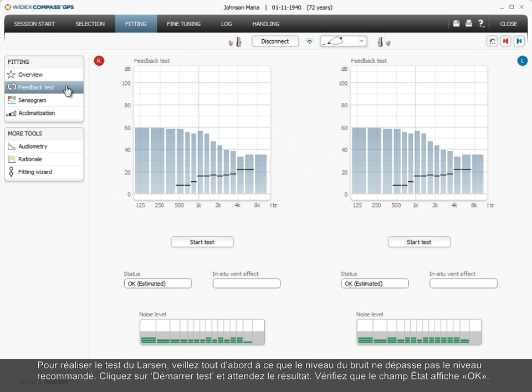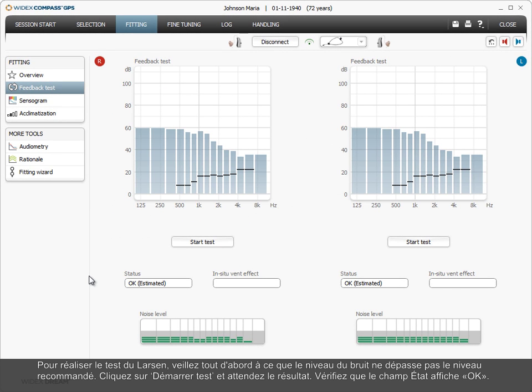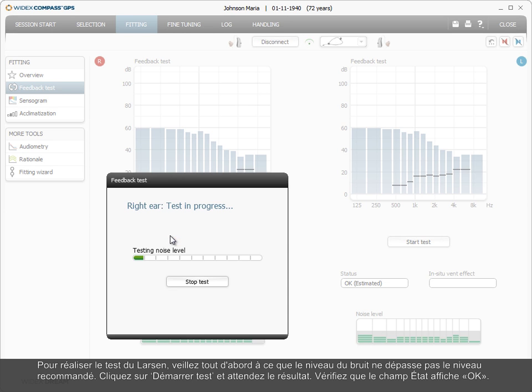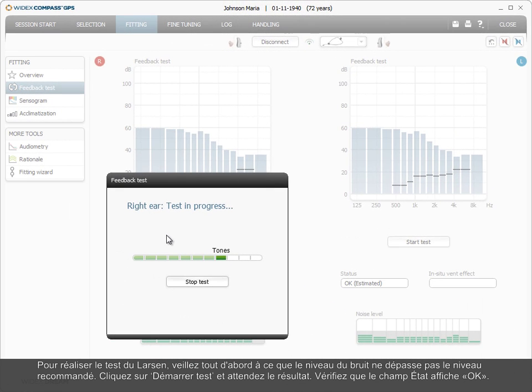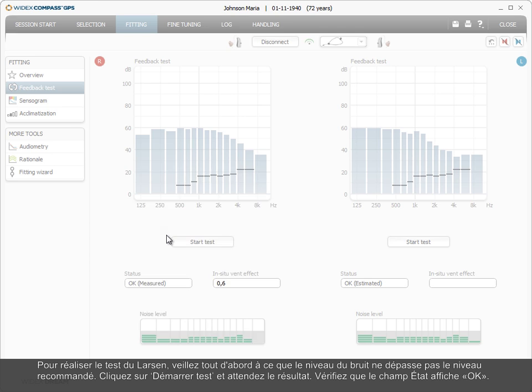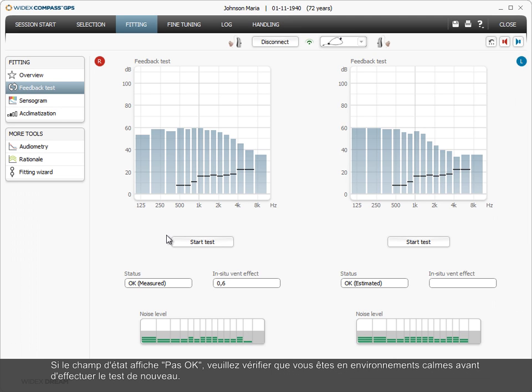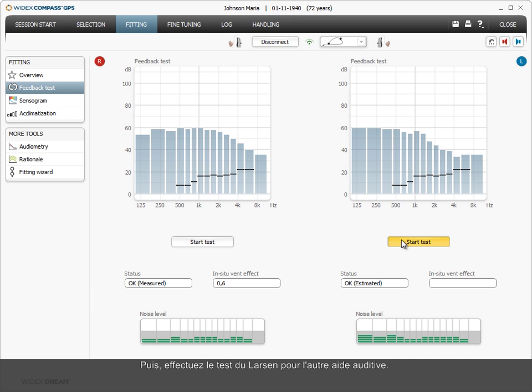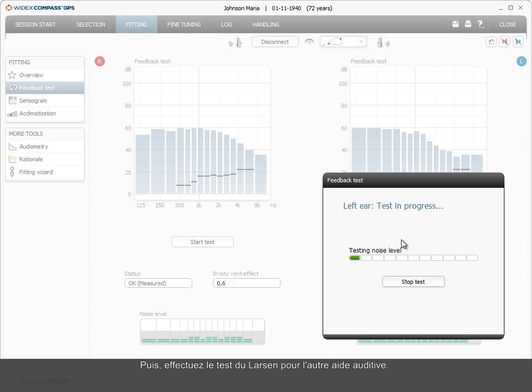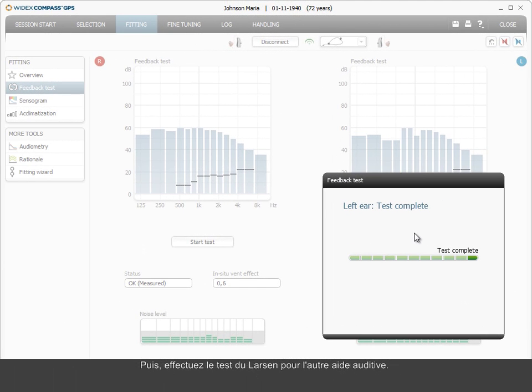To perform the feedback test, first ensure that the noise level does not exceed the recommended level. Click Start Test and wait for the result. Check that the status field shows OK. If the status field shows not OK, please ensure that you have quiet surroundings before running the test again. You can also try to make a tighter fit or reduce the vent size. Then perform the feedback test for the other hearing aid.